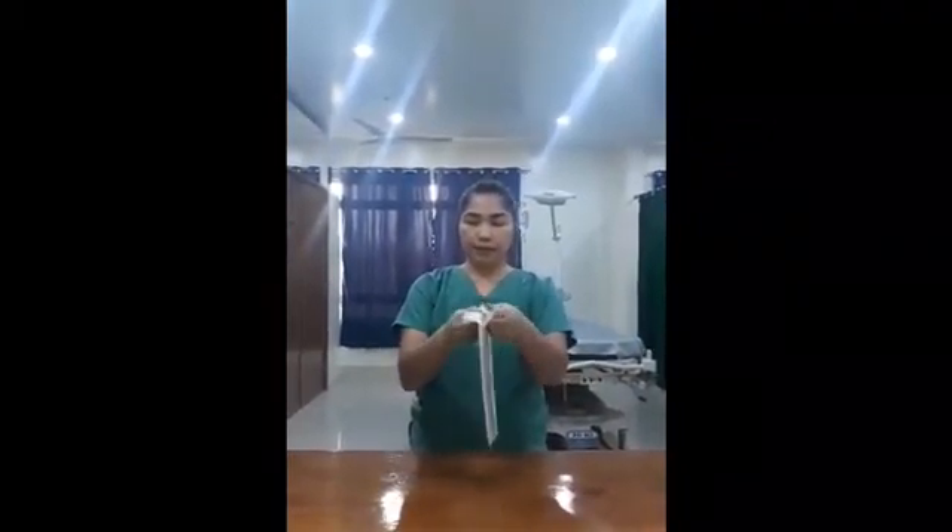The first thing that you're going to do is open the outer package and put it on a clean table. Remember, this is open-gloving. The one that we do in the OR, in the operating room, is a closed-gloving technique — this is a different one. The outer portion is considered unsterile because it's going to touch a non-sterile object, but what is inside is already sterile, meaning you are not supposed to touch it with a non-sterile object, including your hands.